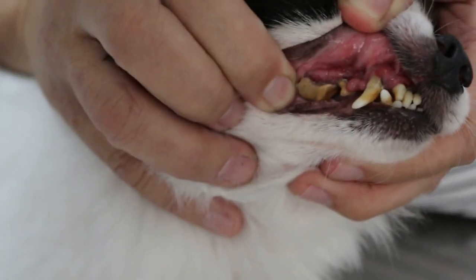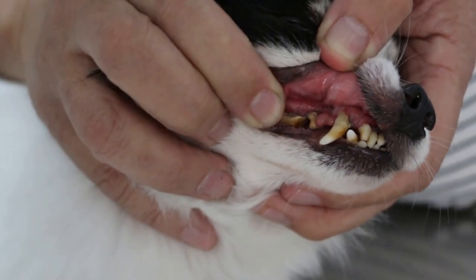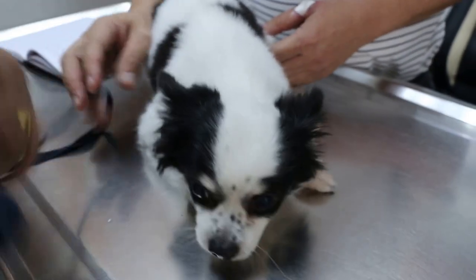So the tartar is here. So at least one regular dental work needs to be done afterwards. Now the dog is in good health. I checked the lungs and the heart — they're okay. So now we can move on.